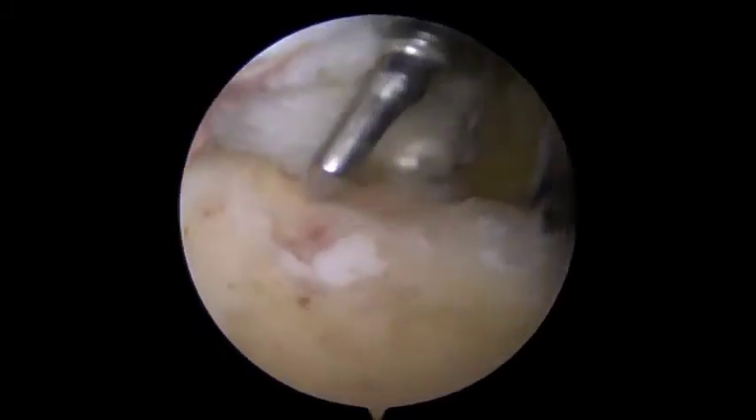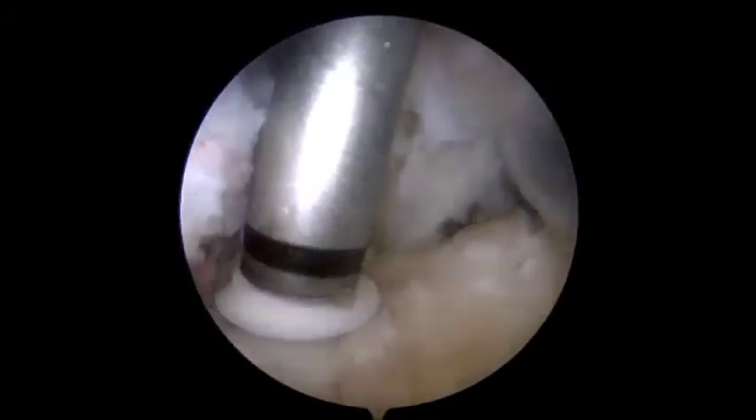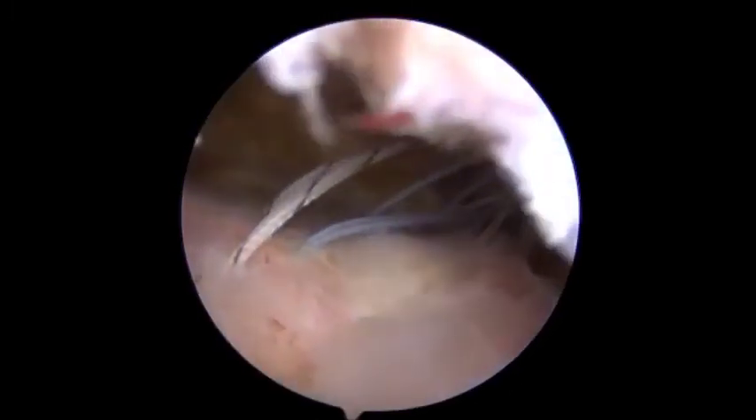Next, the first suture anchor is placed, followed by three others, over the debrided greater tuberosity, over which the supraspinatus tendon is tightly secured in the double row technique along with biceps tenodesis. Since only one working portal is in play, the anterior suture anchors are placed with the shoulder in slight external rotation, while the posteriorly placed suture anchors are inserted with the shoulder in slight internal rotation for better visualization.